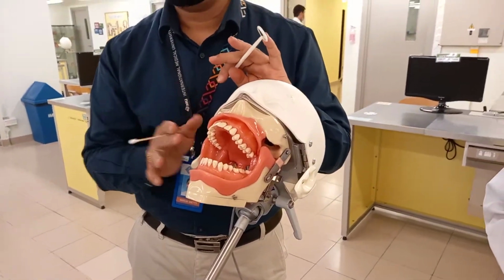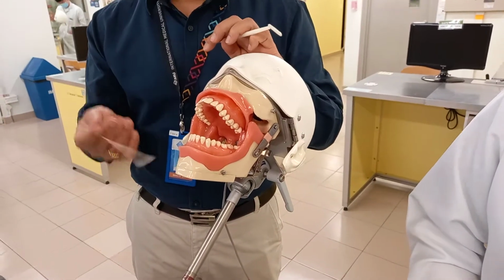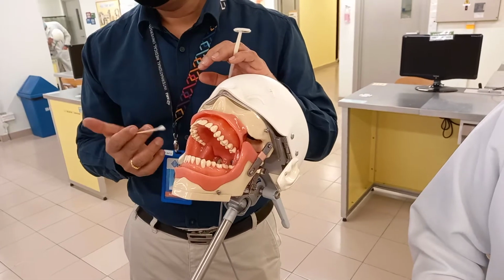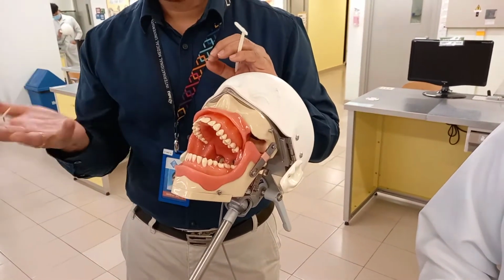Let it set. But you have to inform the patient why you are doing this. The patient needs to know what you're doing. Say, I'm applying topical so that it becomes a bit numb before I give you the anesthesia. Don't say before I give you the injection. When you get scared, just say anesthesia.